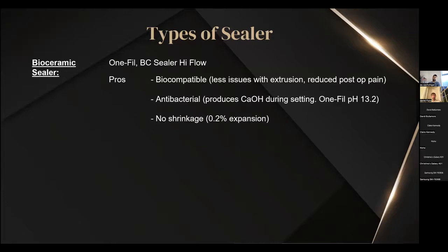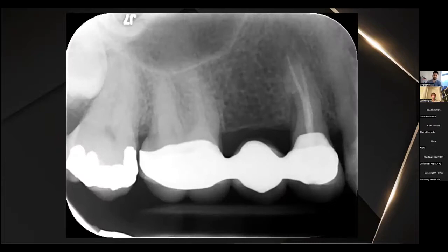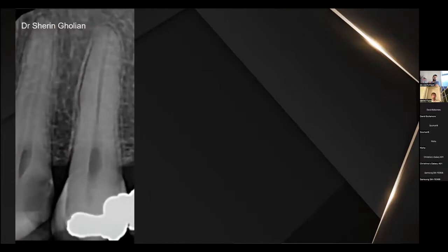It's dimensionally stable, so it doesn't shrink at all. In fact, there is a very minimal expansion, but the main thing here is no shrinkage. I was meant to change this to minimal resorption. Sometimes they don't resorb at all, but there is very minimal resorption. So what this looks like is, this is a case I did with AH Plus, and we've possibly got quite a large lateral canal in this area. But when I followed it up, all that sealer had resorbed. And in a case like this, it's not making too much difference. But there were, so this was a case actually that I saw in a lecture which was given at the American Association of Endodontists meeting.